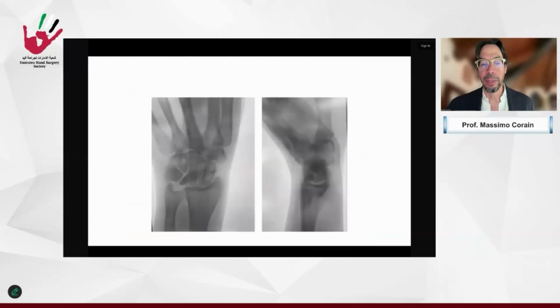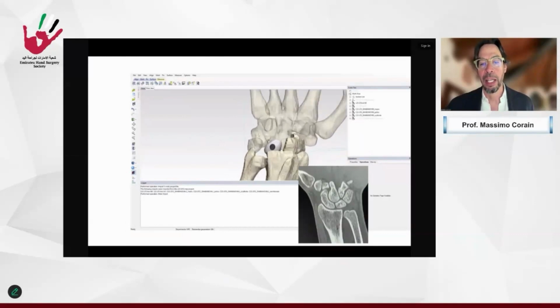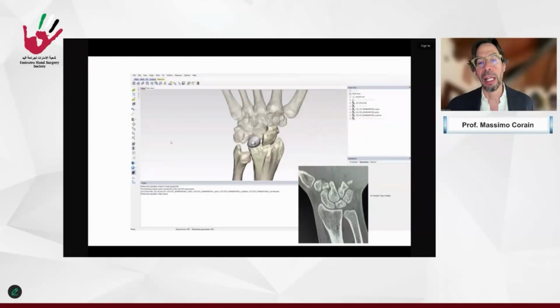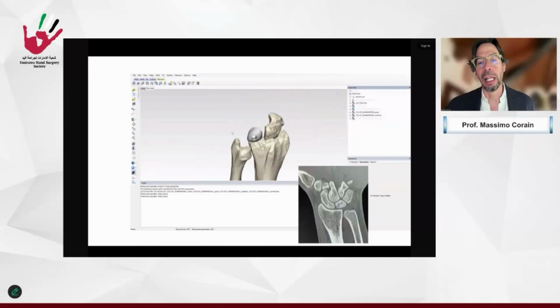And the second case is a similar case, as the lunate, but I asked the engineer to do a different approach, a different hole to fix the lunate in a different way, because the problem of this prosthesis was the risk of dorsal or volar instability. So I decided to use a hole that lets me fix the prosthesis to the volar ligament in order to try to keep it aligned without a major deformity of its position on the scaphoid and the triquetrum.